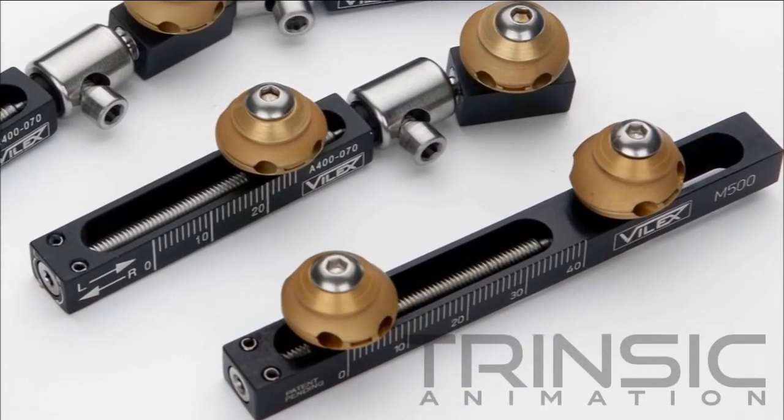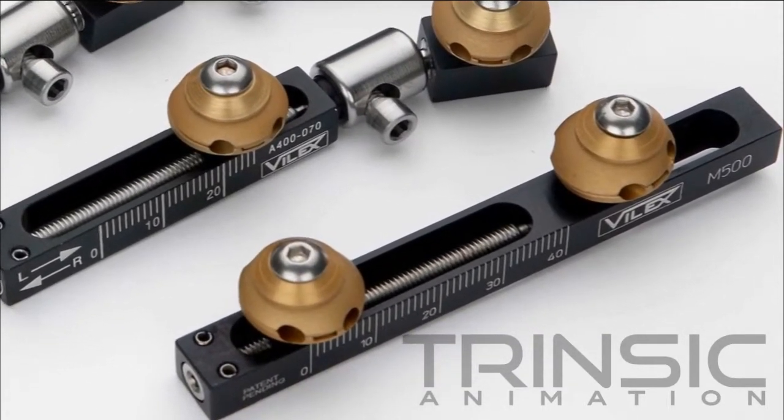In this procedure, we'll demonstrate the use of a Vilex mini-rail to lengthen the first metatarsal.